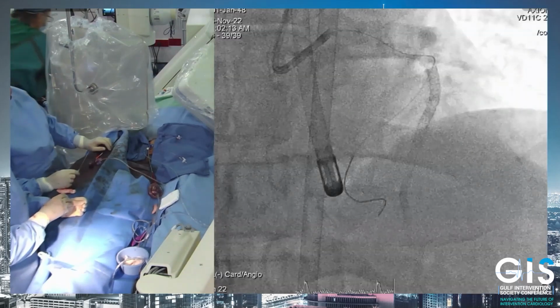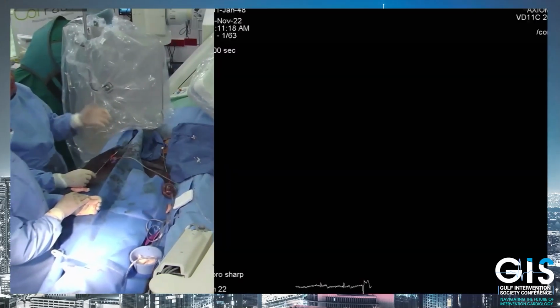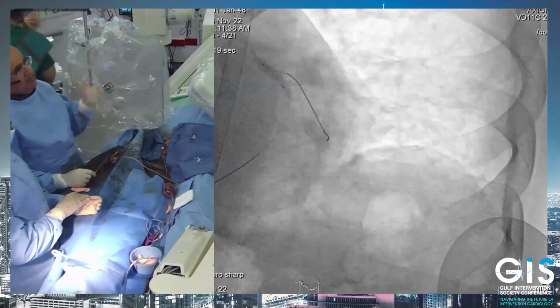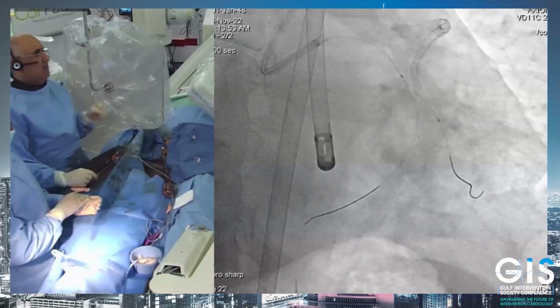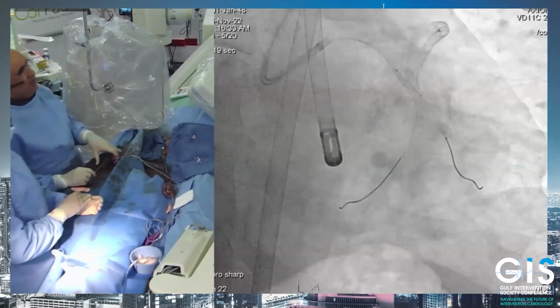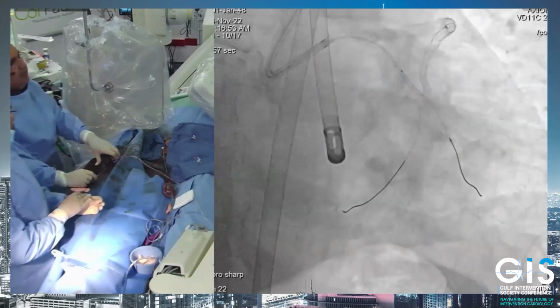What happened is this patient had a recent acute coronary syndrome, and this is a situation where you sometimes underestimate the plaque burden, the severity of the disease. We did imaging OCT. It didn't show significant calcification that could require calcium modification with a ROTA or IVL. So we thought with a kind of scoring balloon, and we did that.